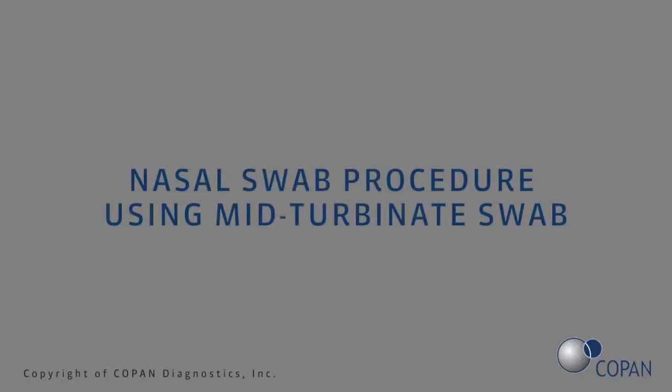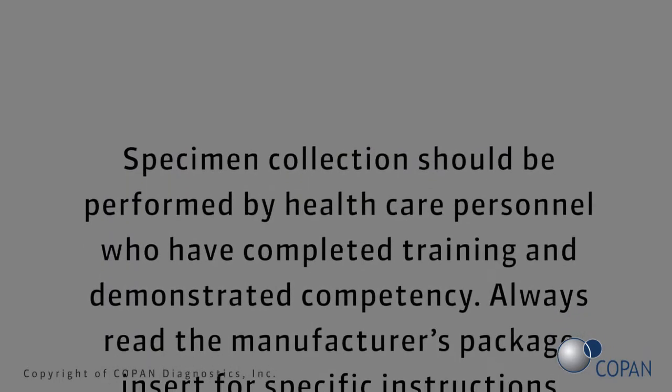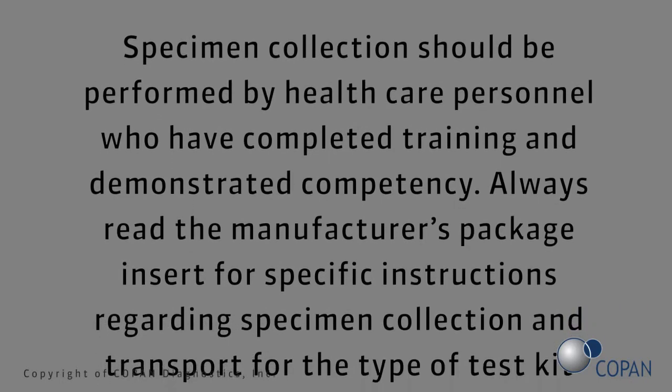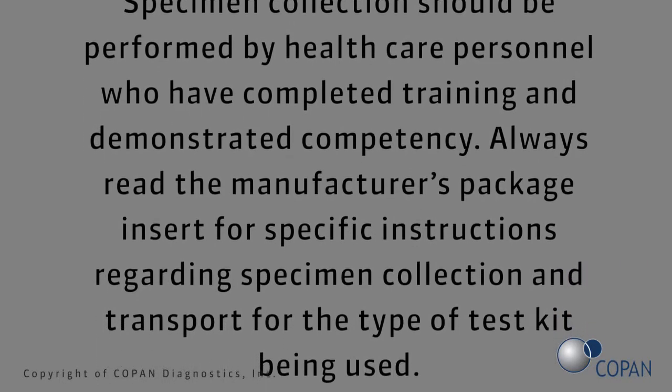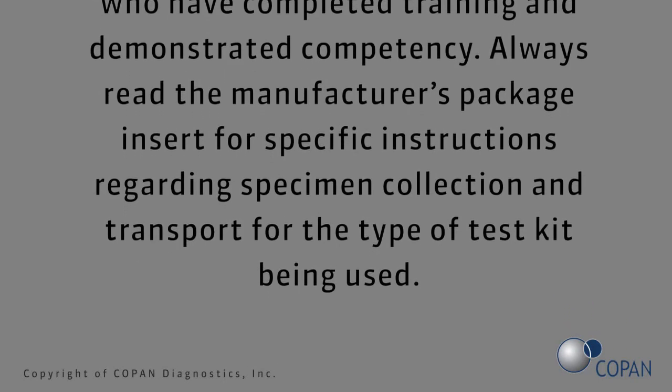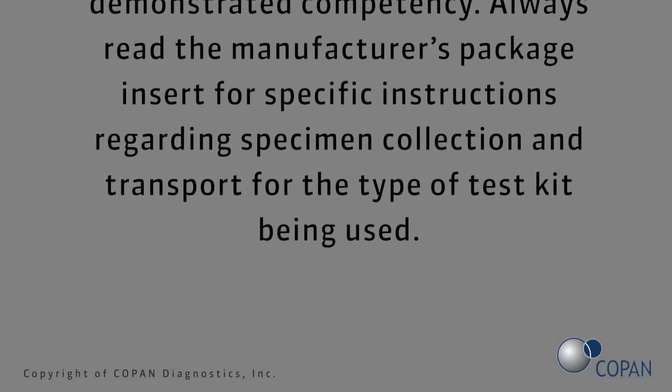Nasal swab procedure using mid-turbinate swab. Specimen collection should be performed by healthcare personnel who have completed training and demonstrated competency. Always read the manufacturer's package insert for specific instructions regarding specimen collection and transport for the type of test kit being used.